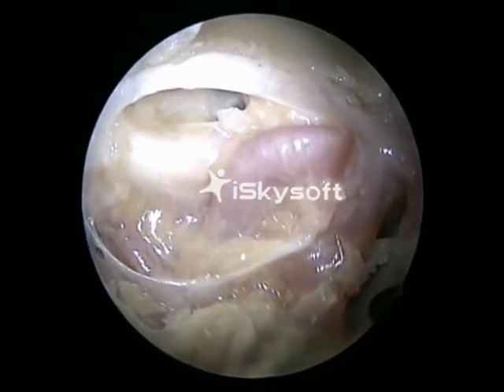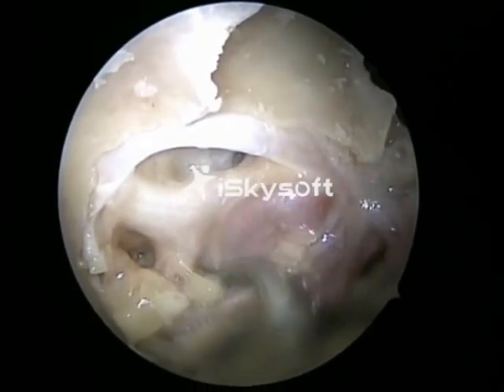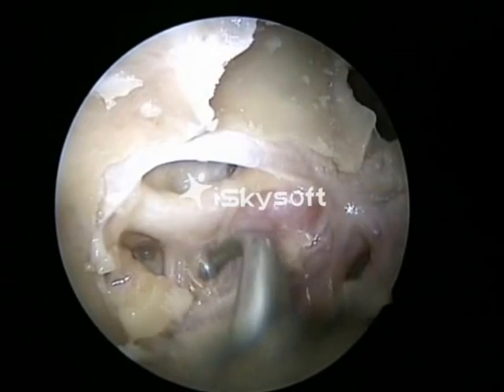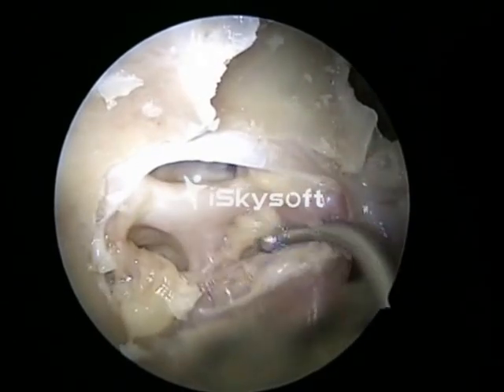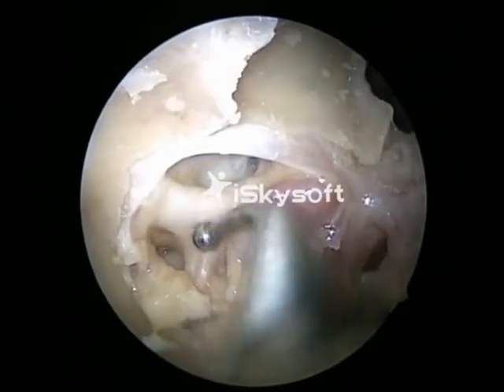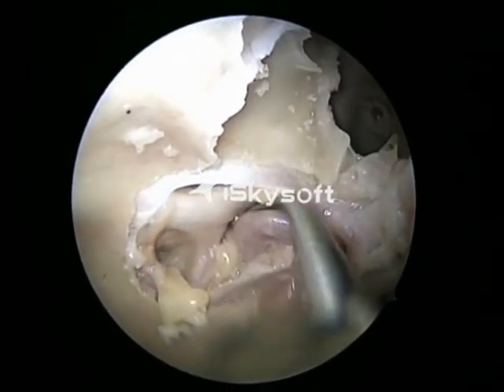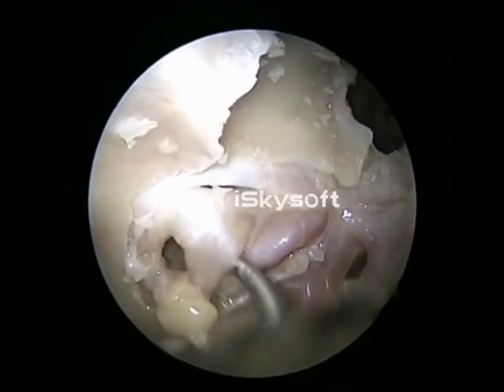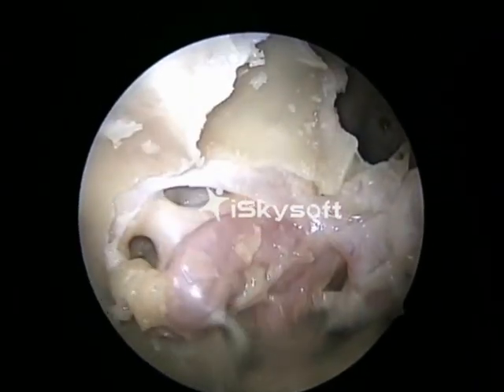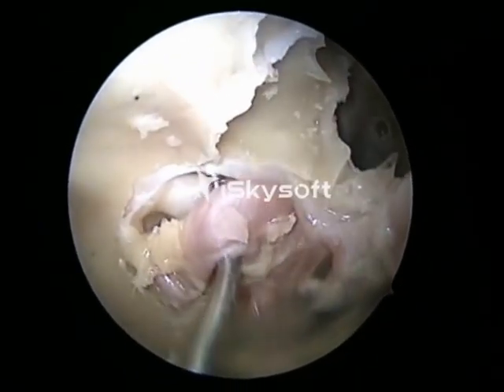That's the internal maxillary artery, the maxillary nerve going as the infraorbital nerve. That's the pterygopalatine ganglion giving off its branches, very clearly seen there, suspended from the maxillary nerve. That's the ganglion. And this is how we ligate the internal maxillary artery.